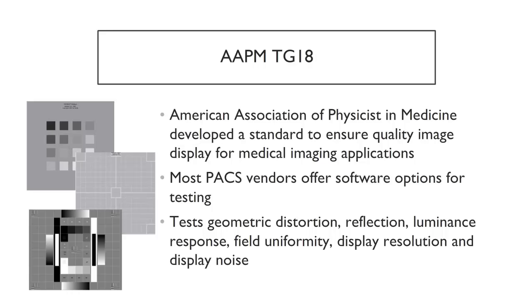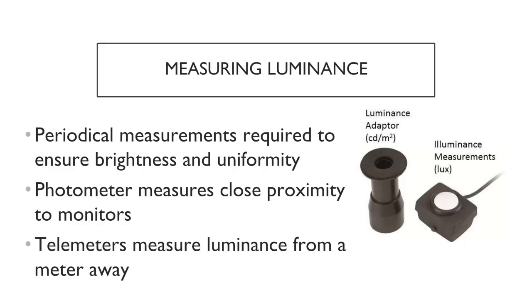It is critical for every monitor of a diagnostic workstation to be set at the same luminance and contrast. Many times monitors come with tools to physically measure the luminance of the display monitors to ensure consistency across workstations. This testing should be done regularly to ensure brightness and uniformity of the monitor. These simple-to-use tools can be utilized by a trained technologist, physicist, or PACS administrator.